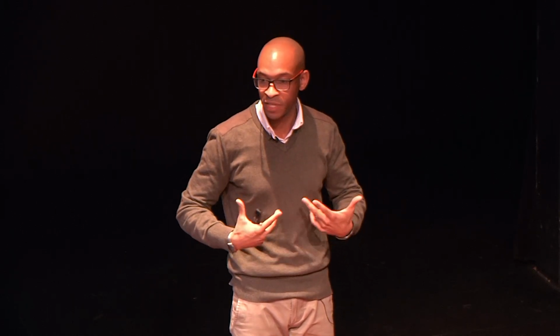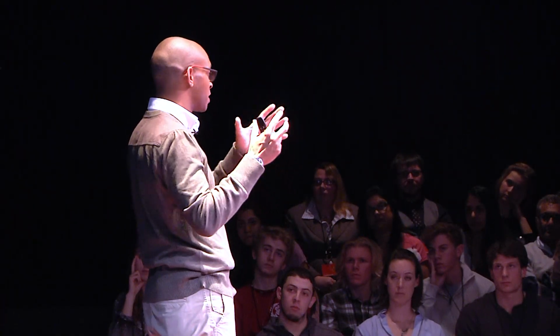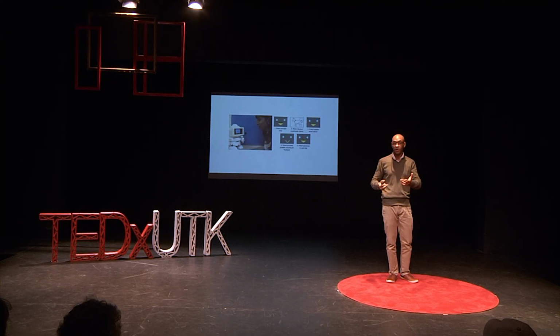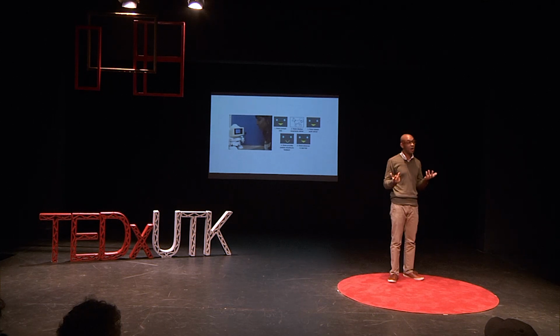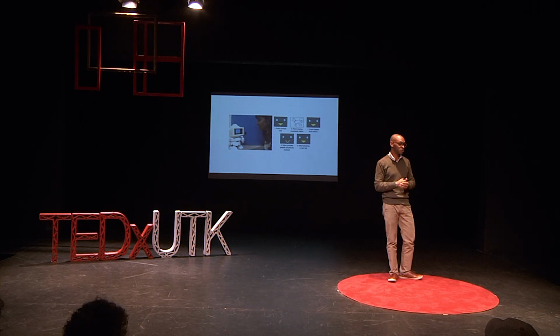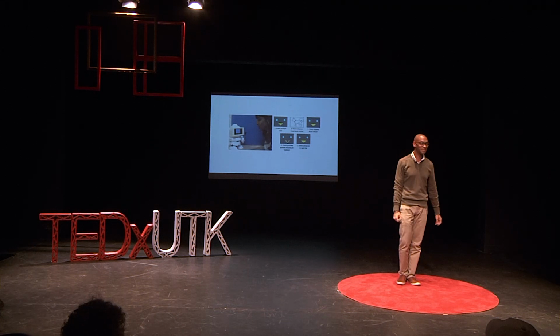Part of the premise behind social robots is that physical embodiment and physical presence helps people to attend more closely to the robot. There's evidence in different populations that if you're using an embodied robot and compare that to a laptop or compare that to pen and paper, you're more likely to persist with the task, you're more likely to focus on the task. Again, this is not for all populations, but certainly for some populations. The children working with these robots are going to be 2, 3, 4 years old. So you see the robot's holding the mic, he's going to put the mic up. We help the kid lean in, wants to interact with the robot.